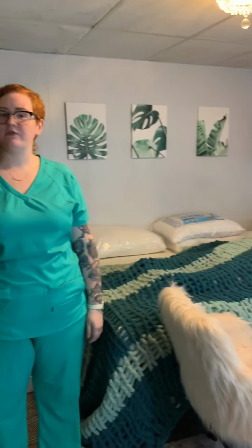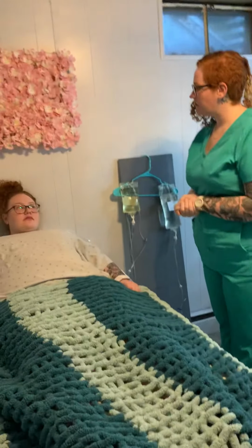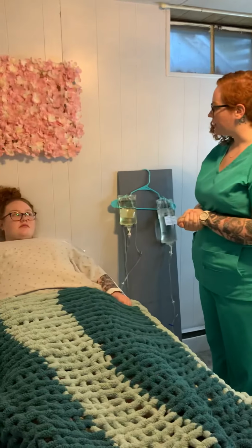Hi, this is Hannah Kincaid and I will be demonstrating administering an IV piggyback with an IV that is incompatible. I will perform hand hygiene and walk into the patient's room and introduce myself. My name is Hannah Kincaid and I will be your student nurse from IVPB.